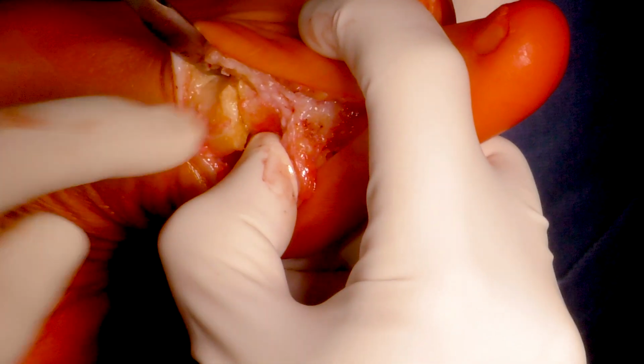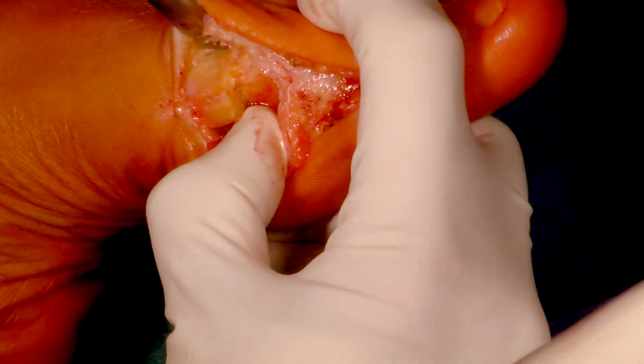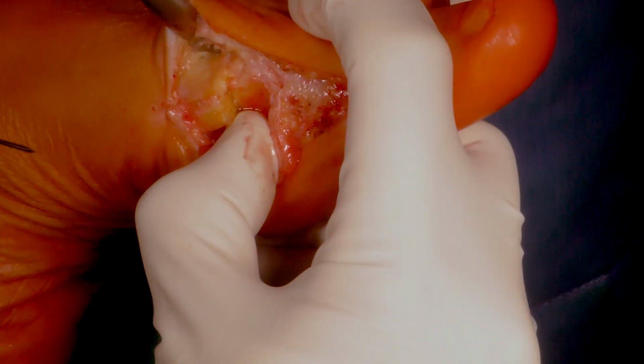By using a Hohmann retractor or a clamp, the metatarsal can be moved medially to allow for a better lateralization of the head.